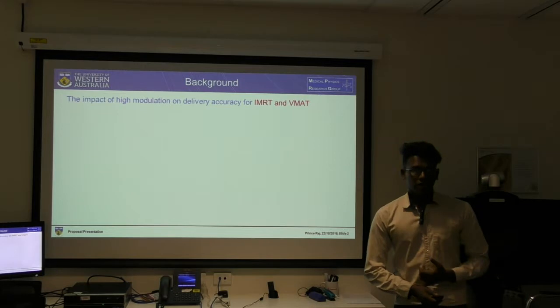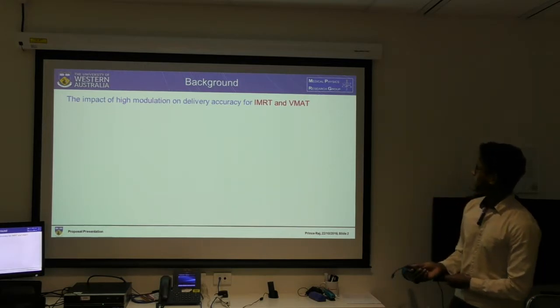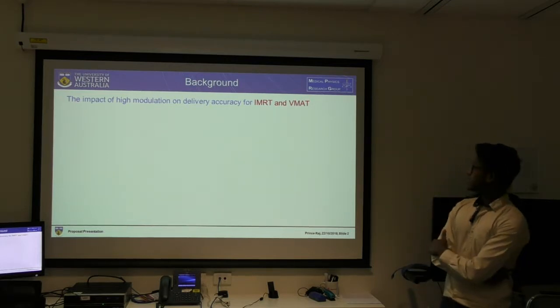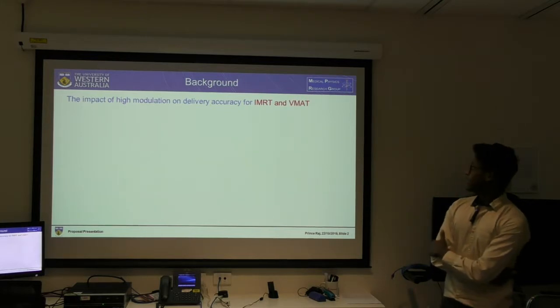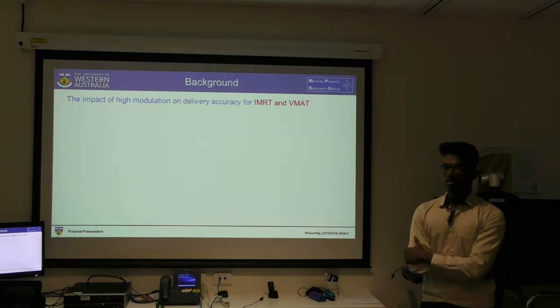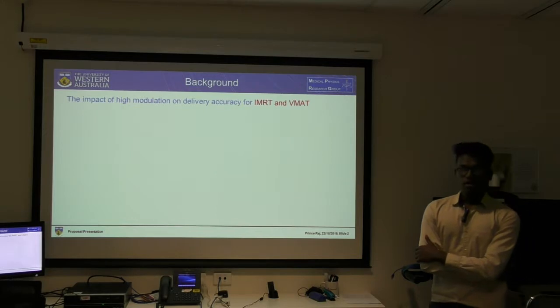So I'd like to break down my thesis title. IMRT and VMAT, as we know, are treatment therapy modalities, which are quite common nowadays. IMRT is called intensity modulated radiotherapy, and VMAT is called volumetric modulated arc therapy.